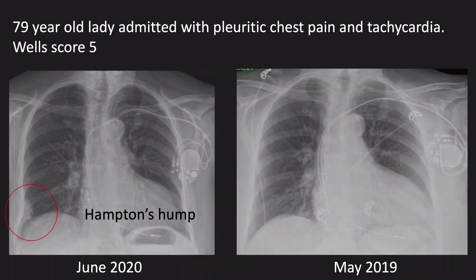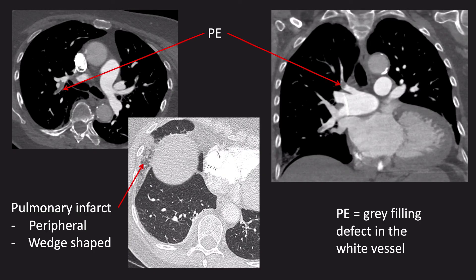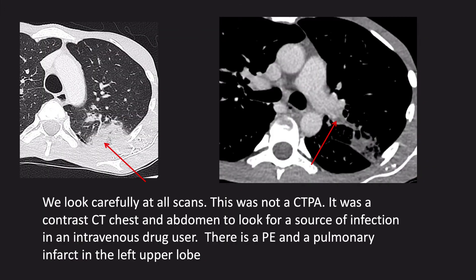This was a 79-year-old lady admitted with pleuritic chest pain and tachycardia, with a WELLS score of 5. On her chest x-ray compared to a previous study from May 2019, she has a pacemaker with right atrial and ventricular leads. On the current study, she has a new peripheral opacity in the right lower lobe called a Hampton hump — a dome-shaped, pleural-based opacity most commonly due to a pulmonary embolism and lung infarct, an area of dead tissue caused by a failure of blood supply. On the CTPA, we can see grey filling defects in the white pulmonary arteries consistent with pulmonary emboli. The associated infarct is seen as a white area peripherally in the middle lobe, corresponding to the Hampton hump seen on chest x-ray.